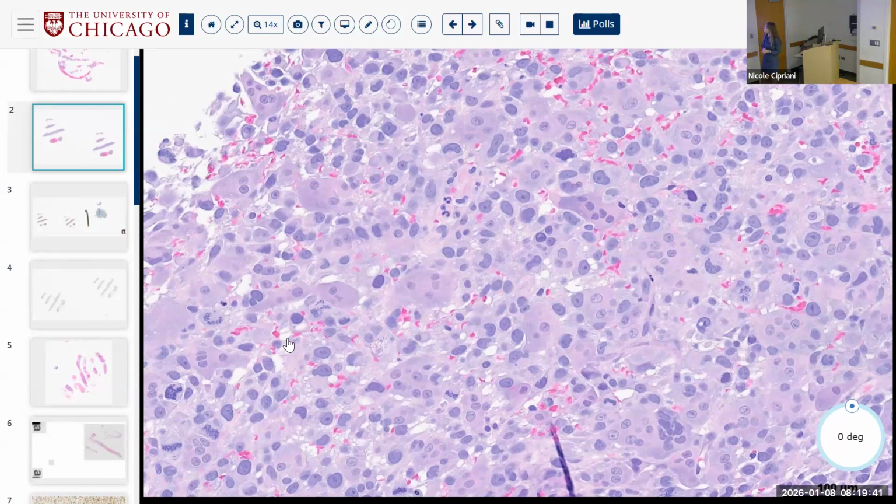Usually angiosarcomas maybe don't have quite this many giant cells, but sure, you could throw a CD31 and ERG on there. In this case, it would be negative. But yes, always when you see extravasated red cells or something that suggests vessel formation, easily do your vascular markers.